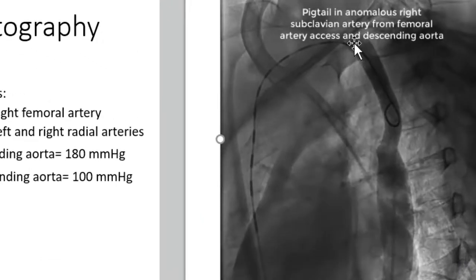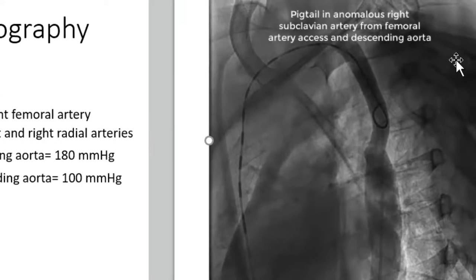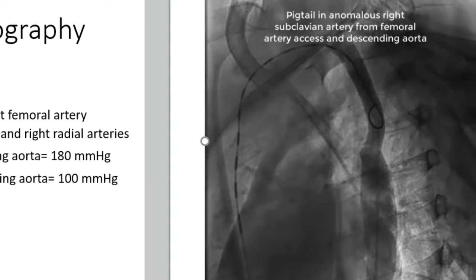And now the catheter is in the anomalous right subclavian artery, approached from the femoral artery axis and descending aorta.